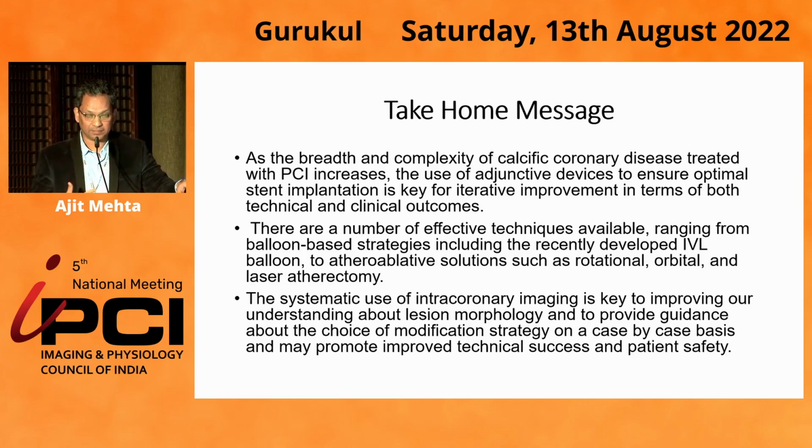Effective techniques are available, like IVL balloon, scoring balloon, cutting balloon, high-pressure NC balloons, or atherectomy, rotational or orbital atherectomy, which is not available with us, but should be used adequately whenever needed. And usage of intravascular imaging is very helpful in most of these cases.